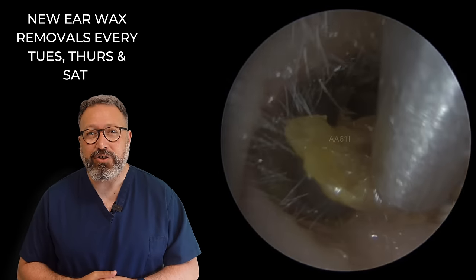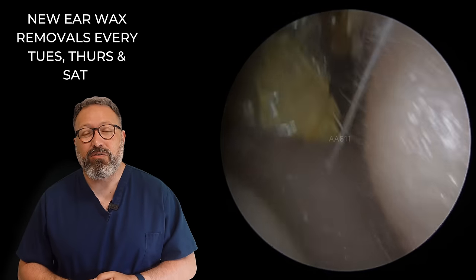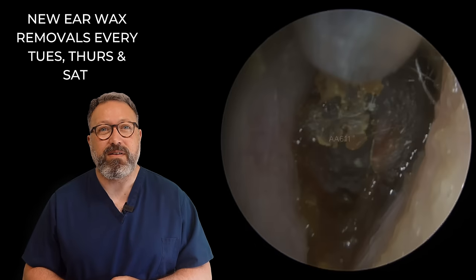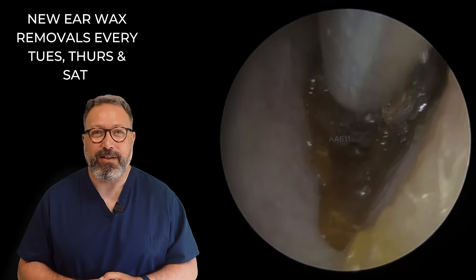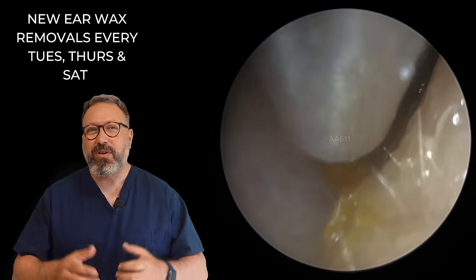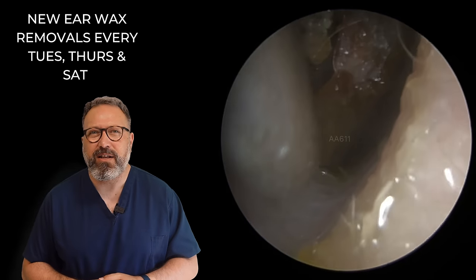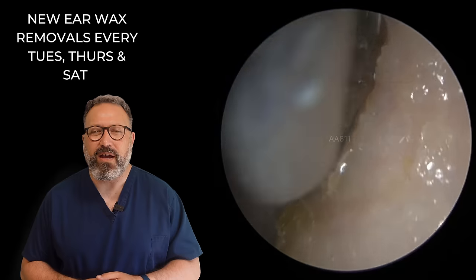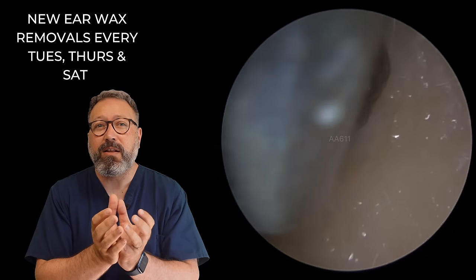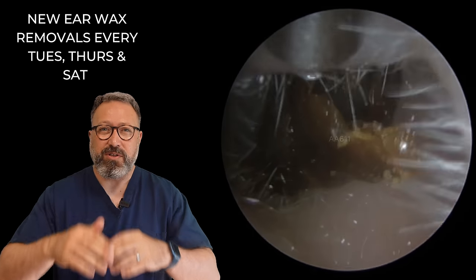We've got a nice flatter section here, which gives us a really good suction grip. You can see all that layer of skin coming away behind it — long, long pieces of skin. And then just tucked behind it, you'll see this plug of dark, hardened wax as well. So we've got everything going on in this particular ear canal. Managed to get a grip on the bottom section — I'm just wiggling this forward, maneuvering it down the canal. You can see it slowly creeping its way down. The reason we couldn't go above this one with a tool was that it was just so perfectly formed to the shape of the ear canal. To get any tools behind it, you need a little bit of a gap to be able to get things like the Rosen Inserter or the St. Bart's Hook in.